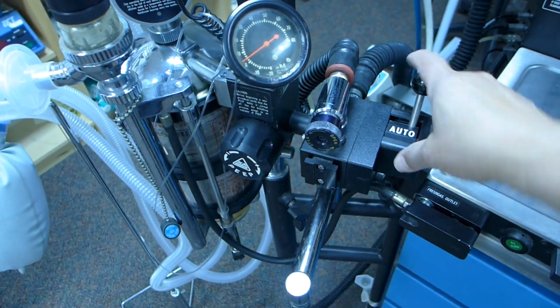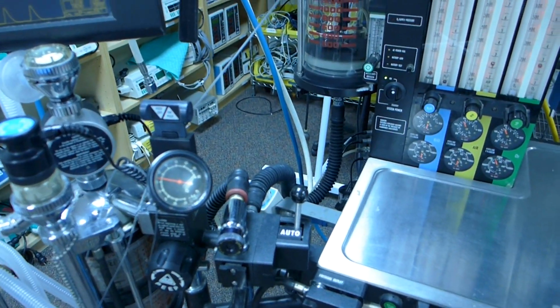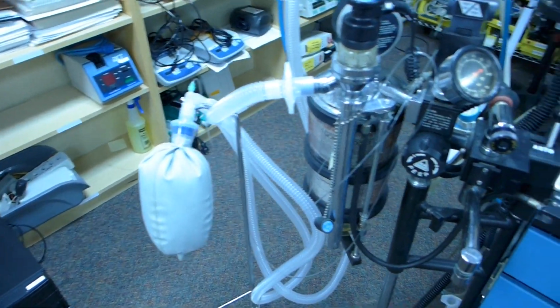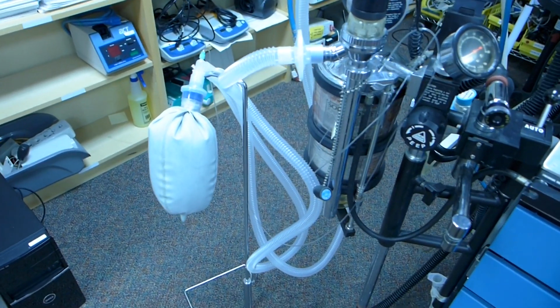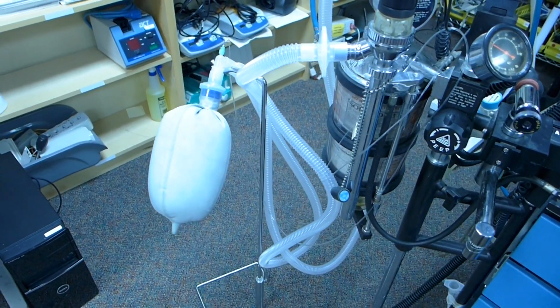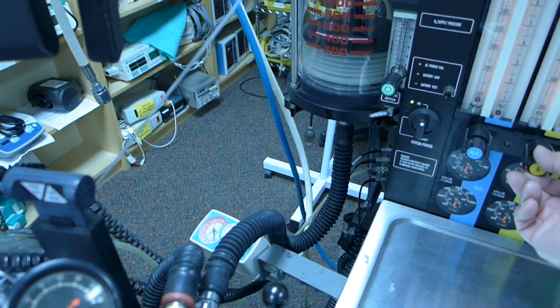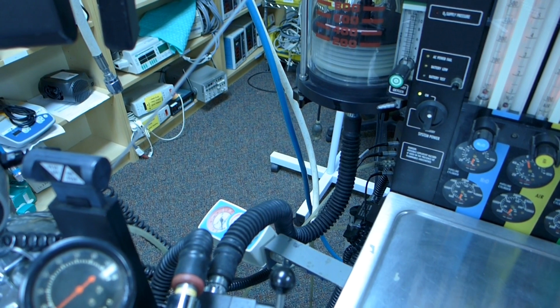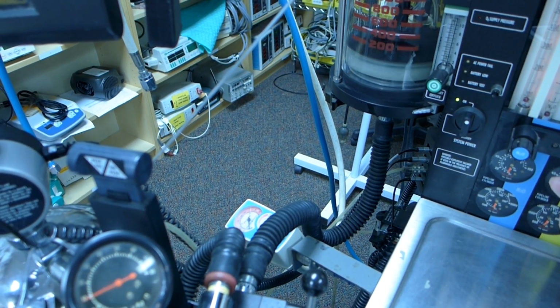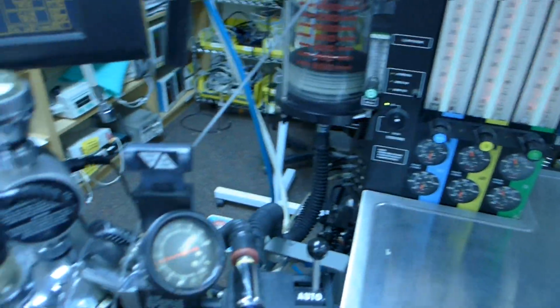these ventilators. Okay, so as you can see, I switched to the auto. This ventilator turned on automatically. The test lung starts to inflate. It's done quickly and automatically. I'm setting the flow rate that I'm giving to the patient right now at 3 and 3. That means the total flow is about 6 liters per minute, right? About 6 liters per minute.